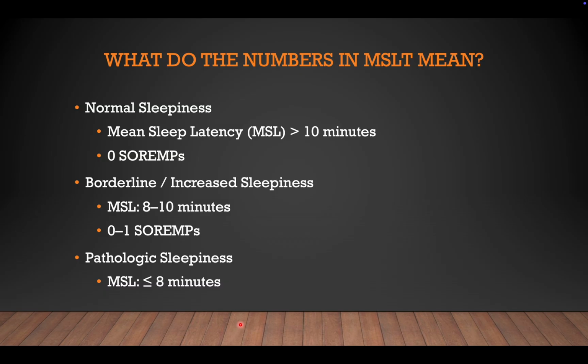If the mean sleep latency is between 8 to 10 minutes, it is borderline. There is a propensity, increased sleepiness. There you may see some 0 to 1 SOREMs here or there. That is in the borderline range. If the mean sleep latency is less than 8 minutes, it is pathologically sleepy.